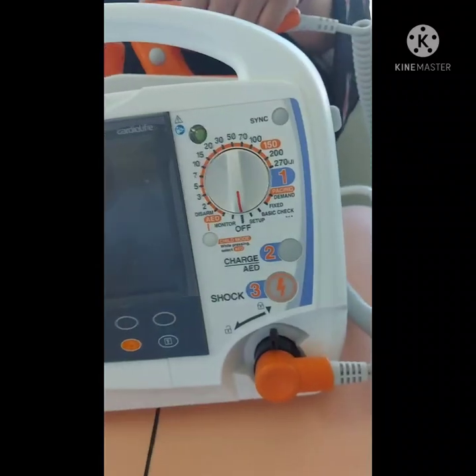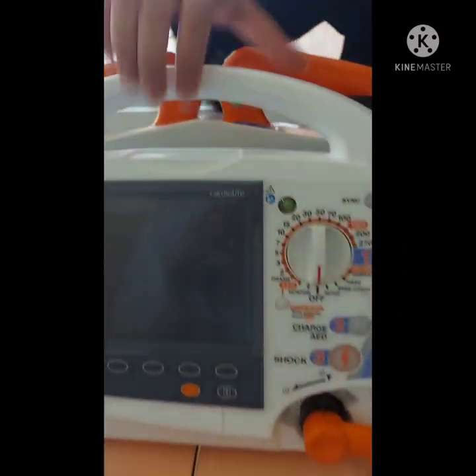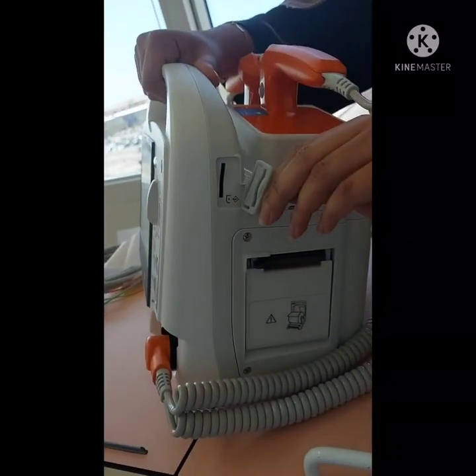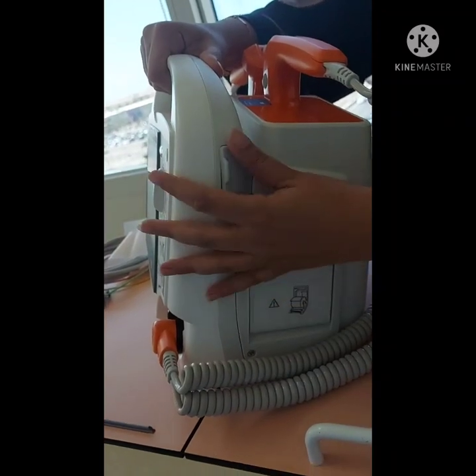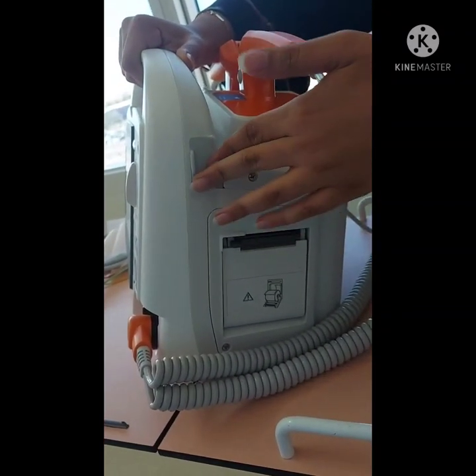But for the paddles, you have to discharge from the paddles themselves. Okay? So from this side, we have a part for the SD card. You can use an SD card here. You just have to purchase it from any library. It's totally fine. We do have the specification for it.